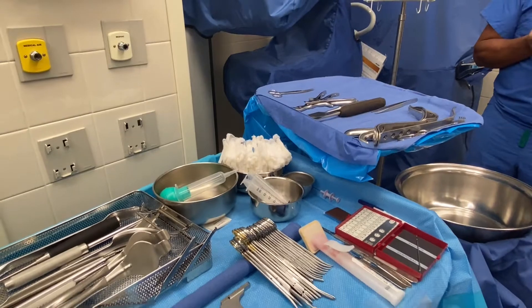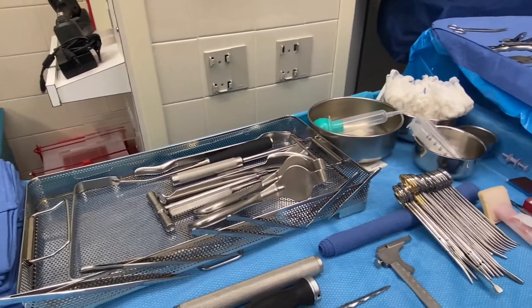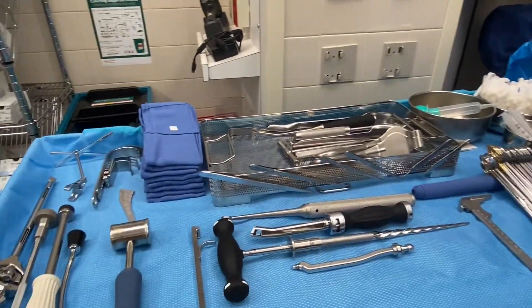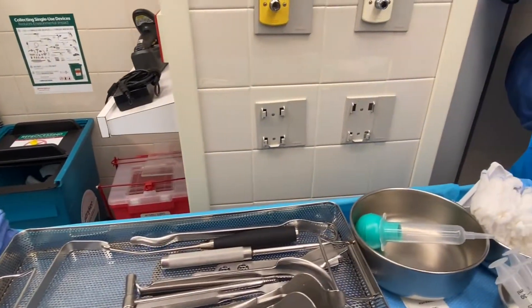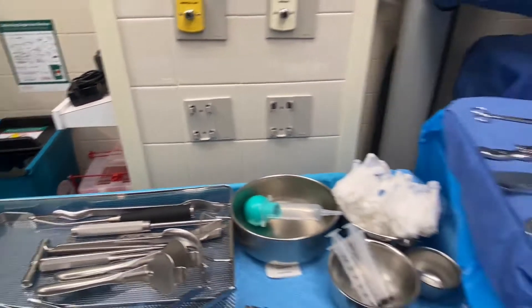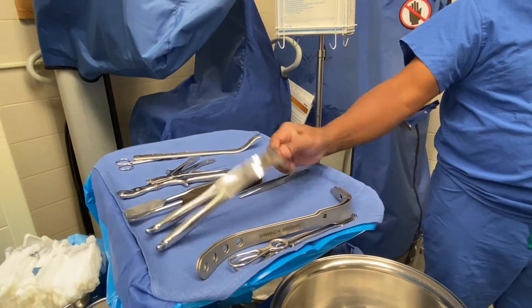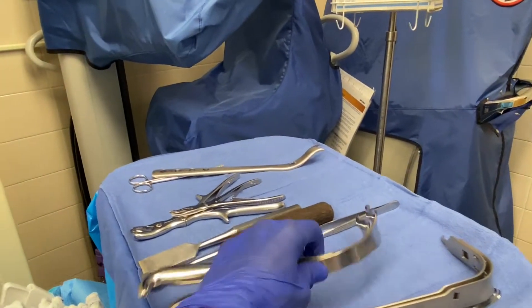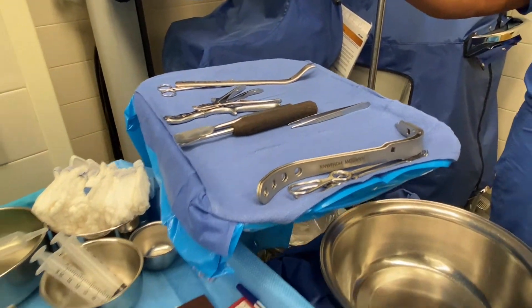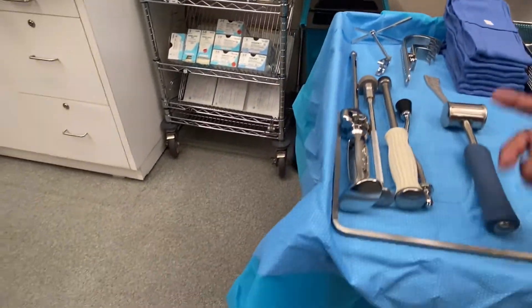Dr. Instrum likes to use a power corkscrew to get the femoral head out. We have one tray in here, and it has the two acetabular retractors. This is the femoral retractor for later — I don't use that for anything.